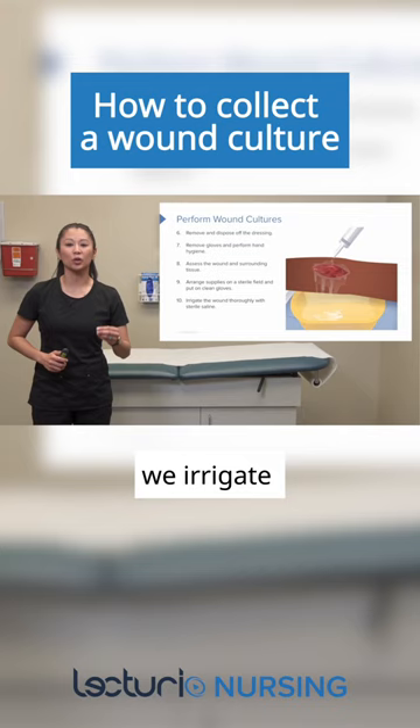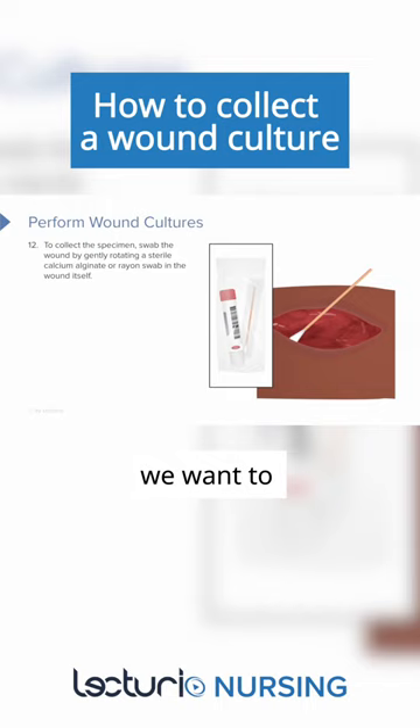Just remember, anytime we culture a wound, make sure we irrigate or cleanse first, then we culture.